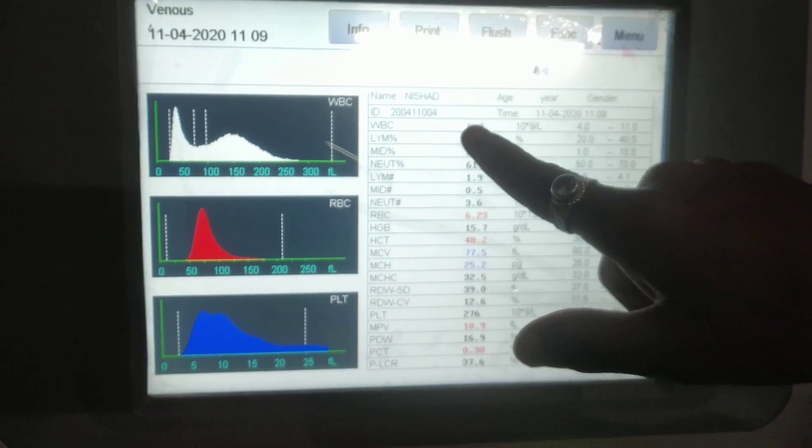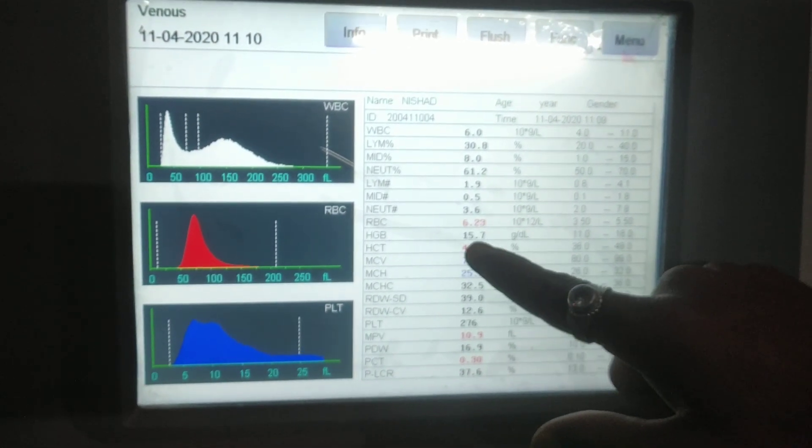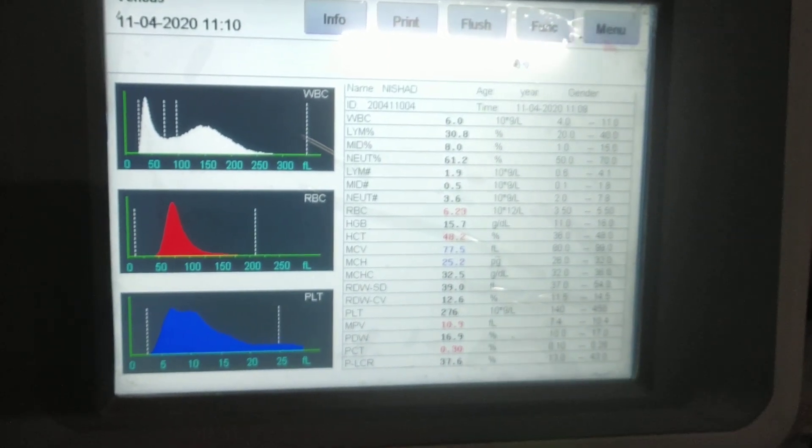We have white blood cells, RBC red blood cells, HB hemoglobin, and platelet count among the parameters.